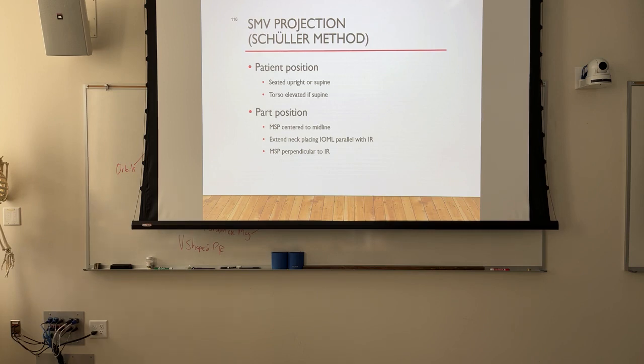You're going to have a tendency on the test to select for a specific question that asks for the cranial base. You're going to have a tendency to want to select Towns or Haas, but according to the textbook, Schuller's shows us cranial base.